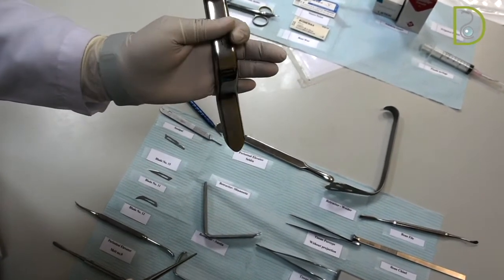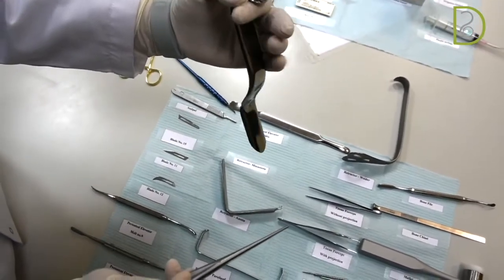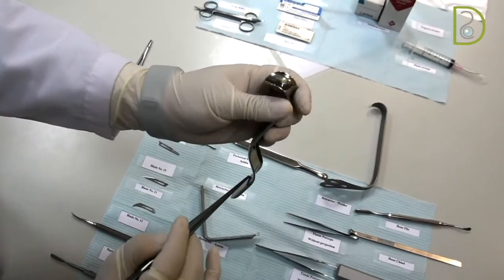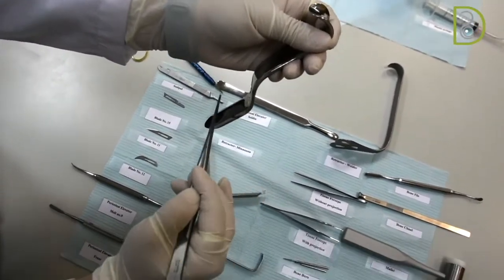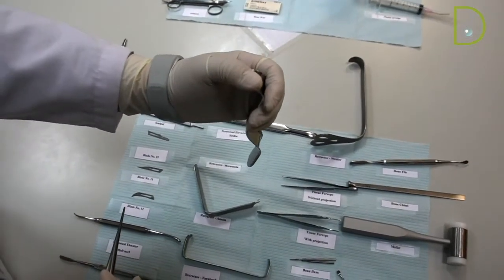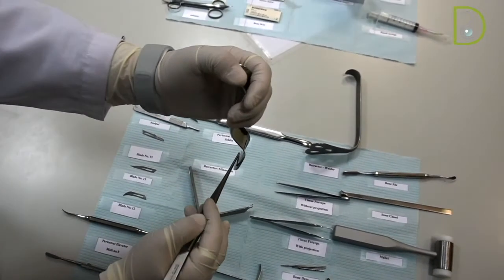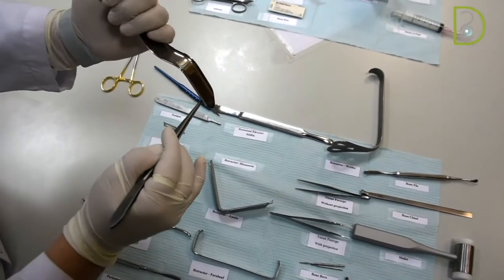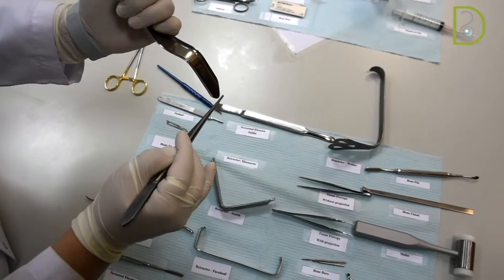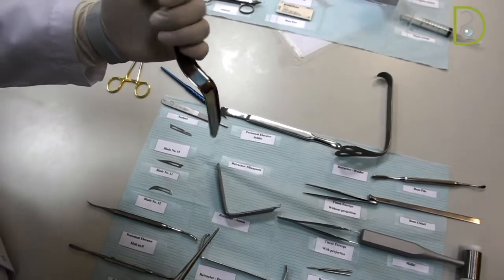And this is Minnesota. The handle is up here. You can handle it from here, and then you will hold your flap. You have to keep the soft edge towards the tissue that you want to retract. So when you position it, this part is toward the bone, and this part is toward the tissue. Then you retract the tissue away. You will depend on the bone as a fulcrum from this edge, and you will retract the tissue away along with the cheek. So this is Minnesota.